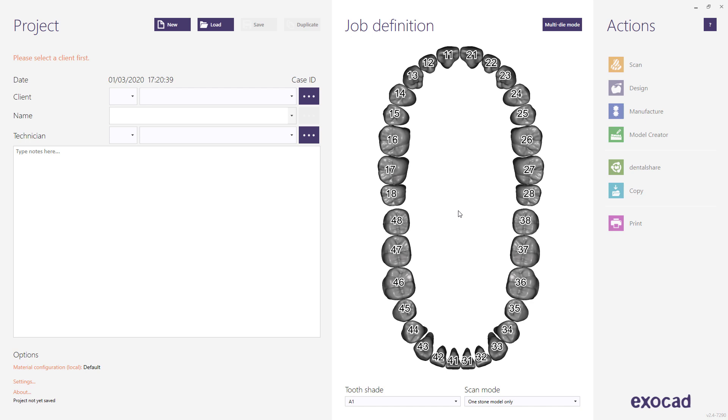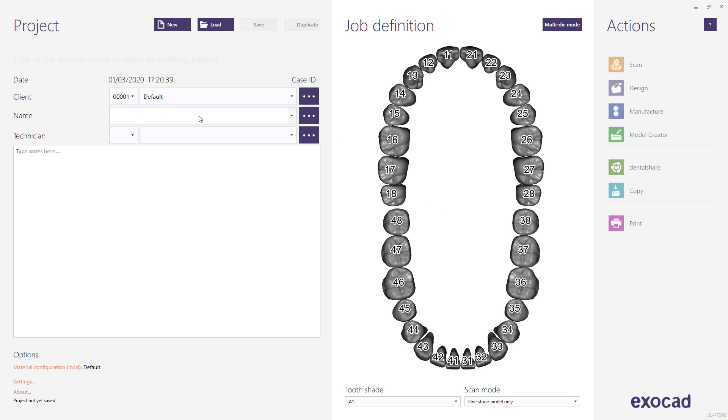To start, run the DentalDB application. Select a client from the drop-down list. Enter the name of the patient or case. Use a comma to separate surname and first name.